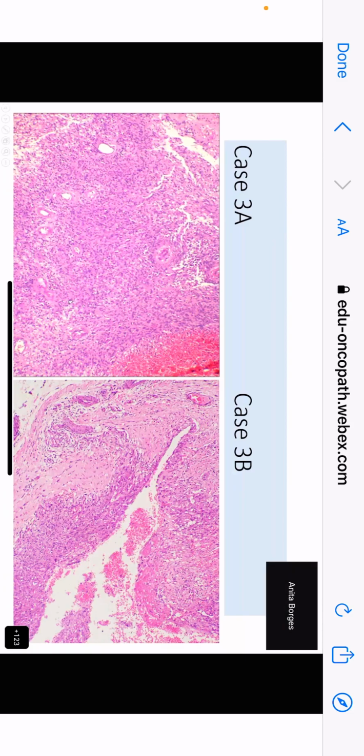It may be that the fascicle is actually cut at right angles, and that's why the cells don't seem to have very spindly nuclei. That happens when you have a broad fascicle that is cut obliquely or at right angles. And on the right hand side, there are more sheets. There are not too many fascicles. But what do you want to say about the spaces? You said that you thought they were blood vessels, these spaces. Do you think that these are vessels, Vimi?